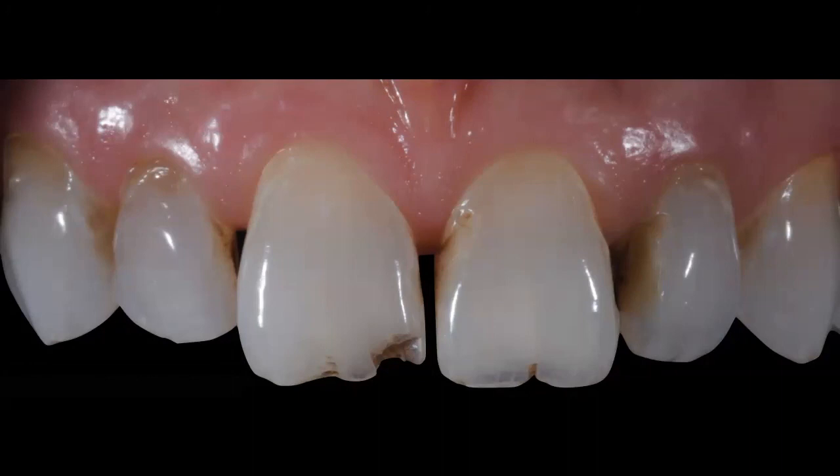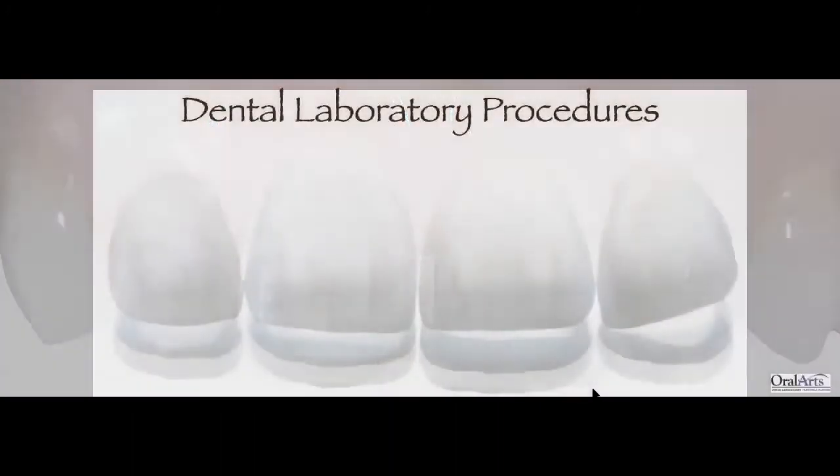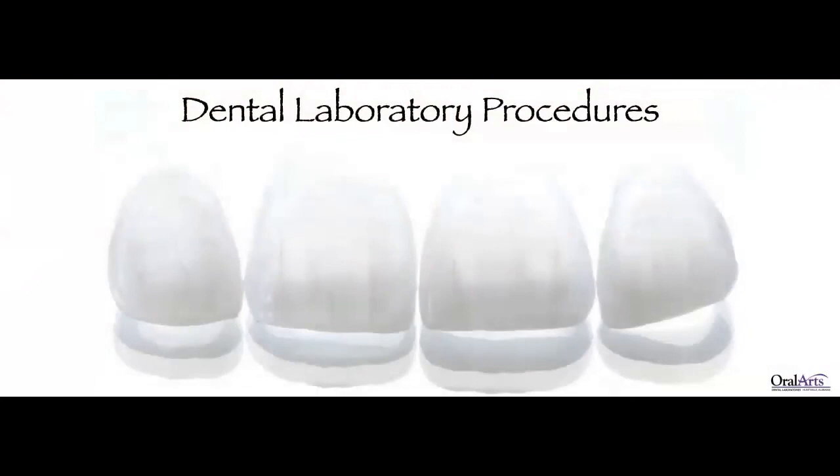You both work as a team, and you communicate as a team in order for you to deliver this type of result. So I want to share with you this last case that was done by Oral Arts as well. And I want to share with you here just the artistry in these ceramist's hands. I want you to see these are four veneers for that case, that photo that you just saw. And look at the translucency, these are all feldspathic veneers. Look how thin these veneers were in the incisal and middle third. Look at the way the light was transmitted through those ceramic veneers.